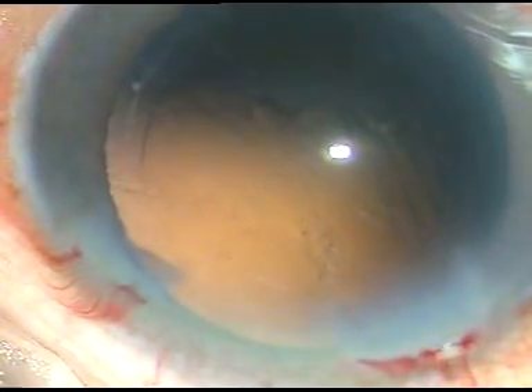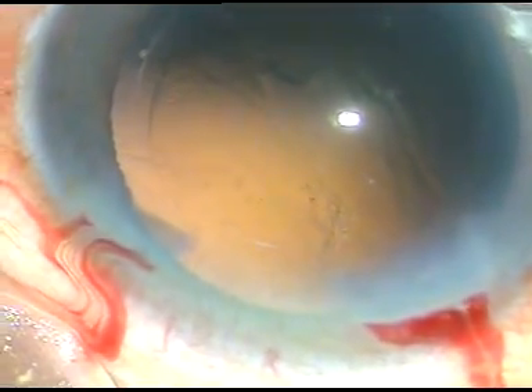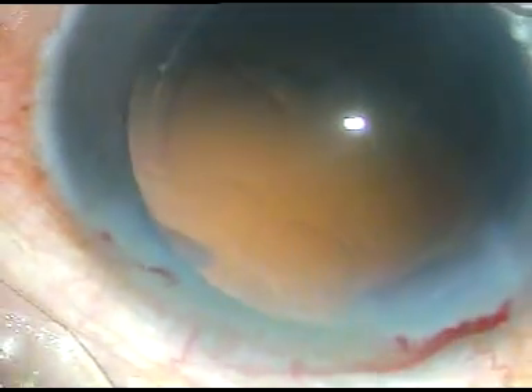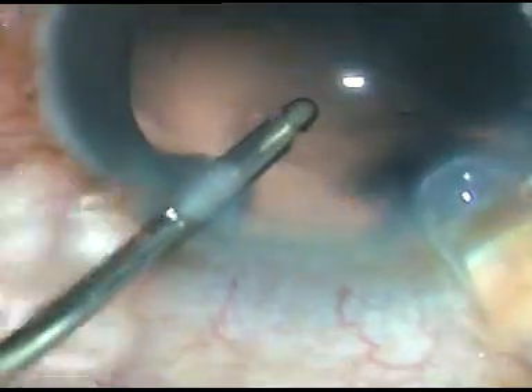The posterior capsule is clear. There are no cells. A little bit of polishing is being done. Now in this case, I have selected a hydrophilic acrylic intraocular lens and it is being implanted under irrigation. The irrigating fluid will keep the anterior chamber formed and the lens will be delivered into the capsular bag. Some more polishing is being done just by the irrigation. This irrigating fluid will wash off the cells. Now this irrigating fluid is keeping the anterior chamber formed and here goes the intraocular lens.